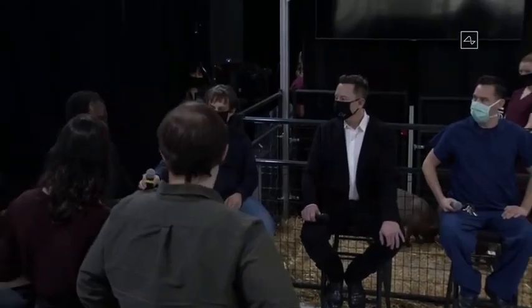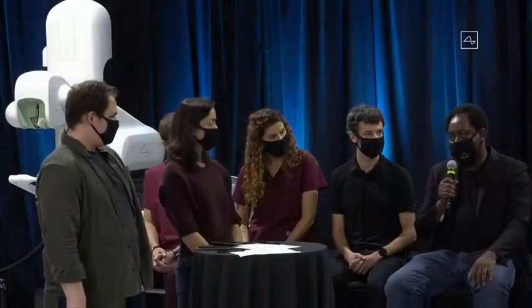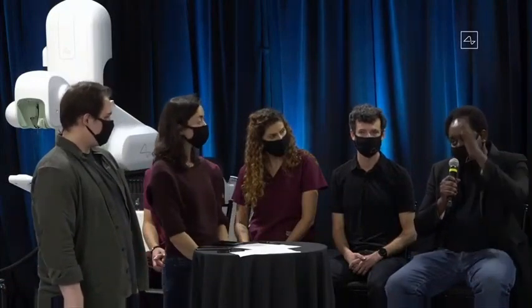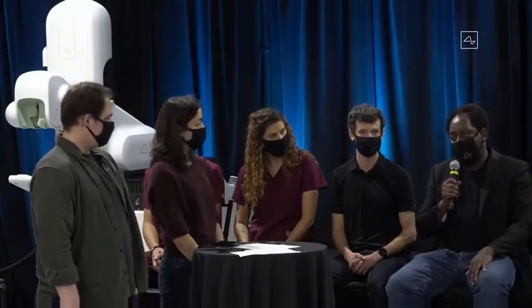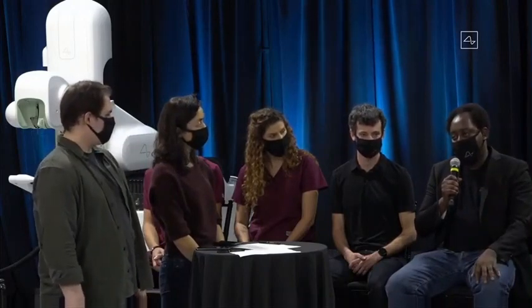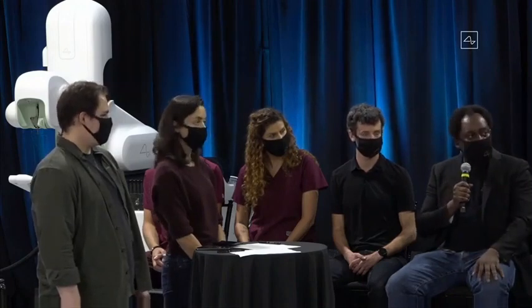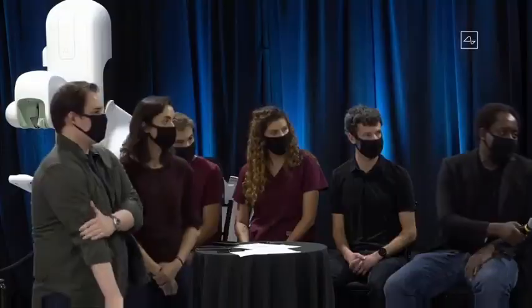And when you say thin, how thin? So one strand of your hair is about 100 microns in diameter. We can think about dividing that into 20. So one of the thicknesses that we're working on is about 5 microns, and we have the possibility to go even thinner in the nearest future. Yeah, we think we can probably go sub-micron in thickness, but obviously, the thinner you make the wire, the harder it is to sense the signal and to do stimulation, because there's less cross-sectional area for the current to traverse.